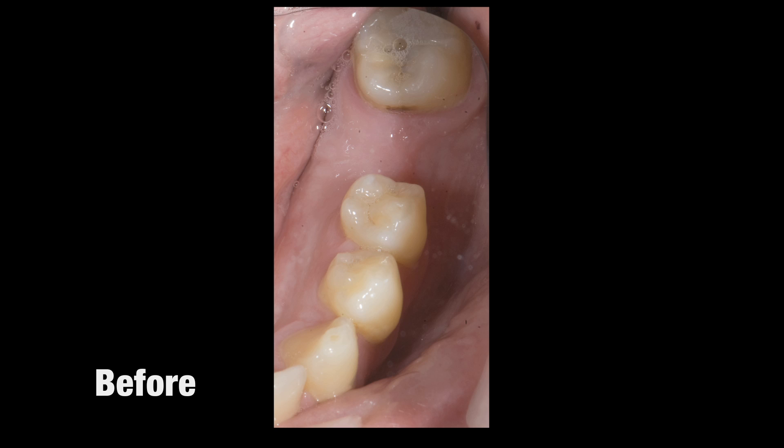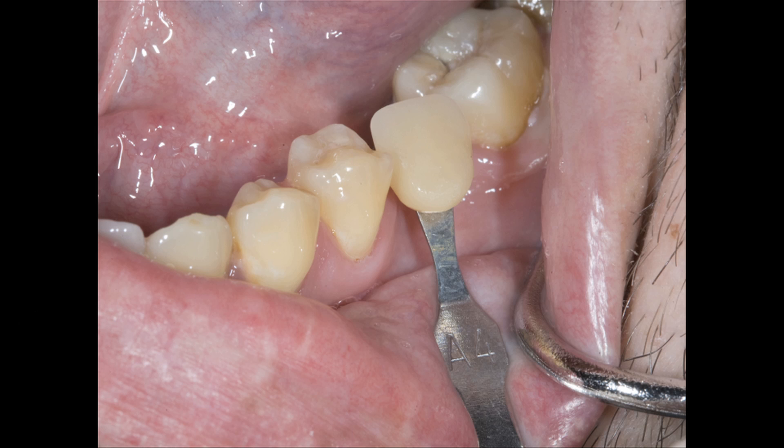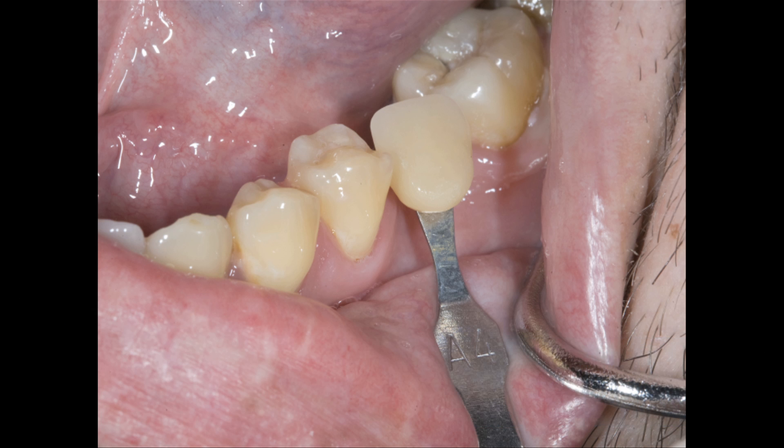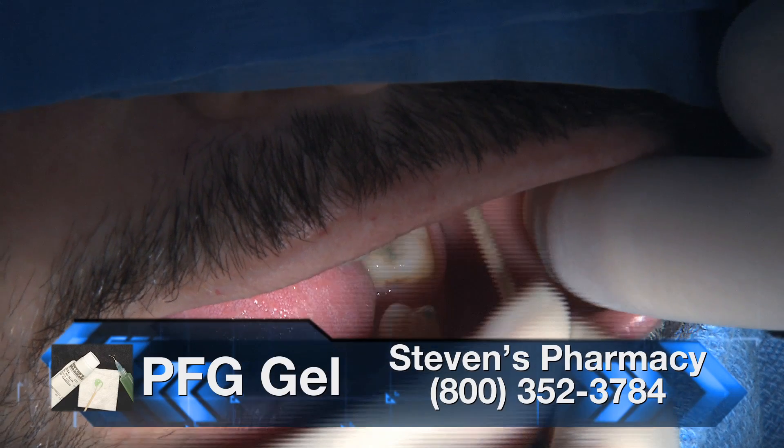Here's what that case looks like clinically. We've got tooth number 19 missing, where we're going to place the implant. I've used the Vita Easy Shade, and it told me the adjacent tooth was an A4. We're putting the A4 shade tab into place and taking a photograph to send to the technician — it's telling me A4 is the closest shade, not an absolute perfect match. Now it's time to anesthetize the area.